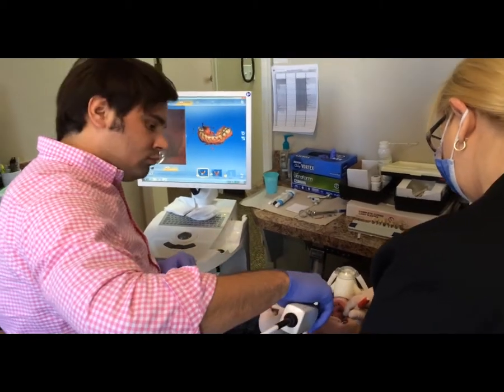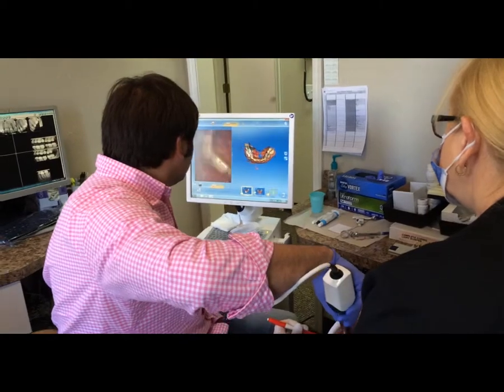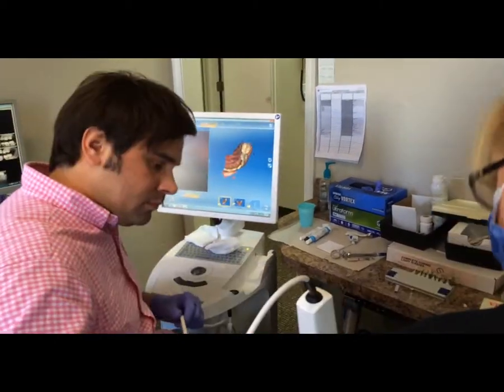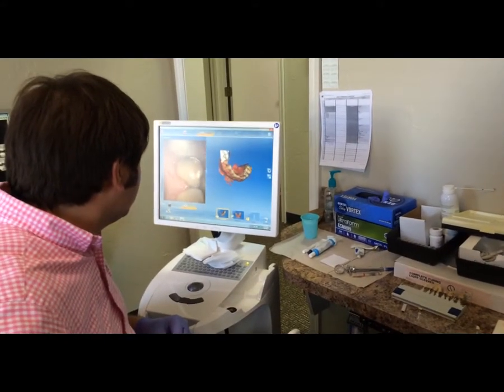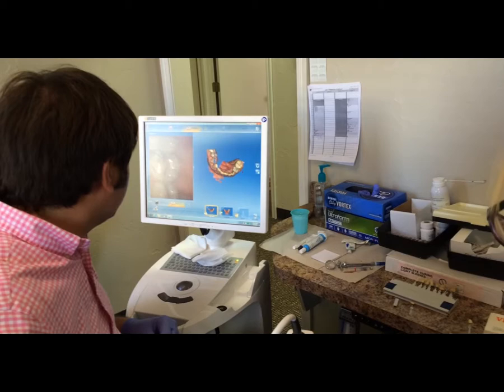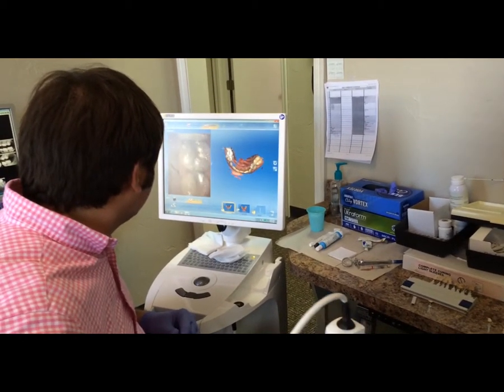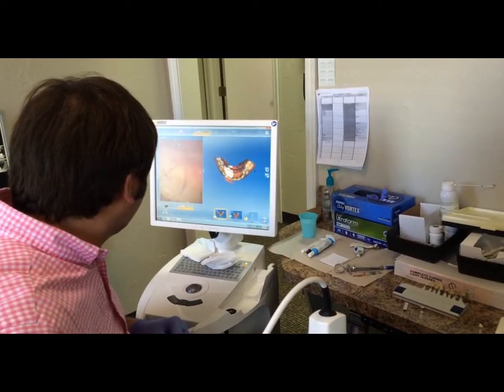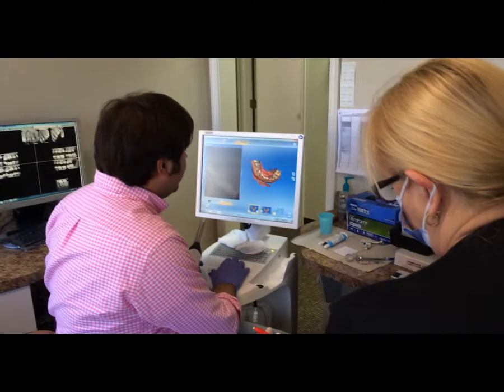Here we see him going back towards the back molars and premolars to hit the occlusion once again. He comes around and scans the lingual aspect to get that information. One nice feature of the Omnicam DI is that if you get a bad scan that throws the information off, you can easily use the cut tool to remove that information. The technician was then able to go back to his last good spot, rescan the needed information, and have it fulfilled into the model.